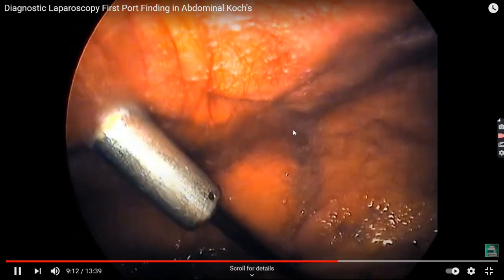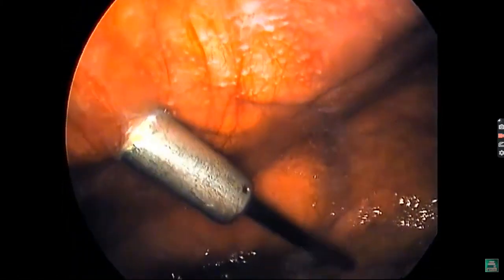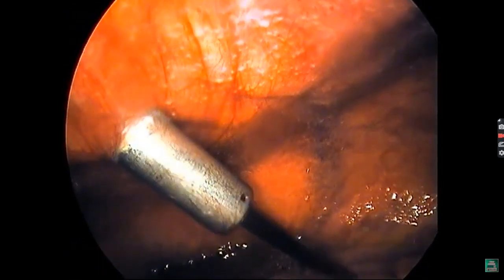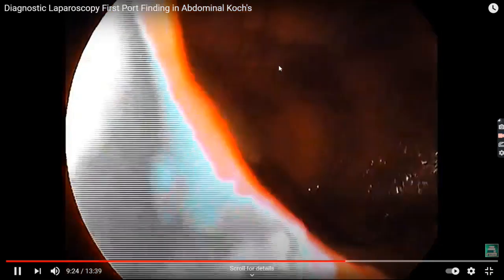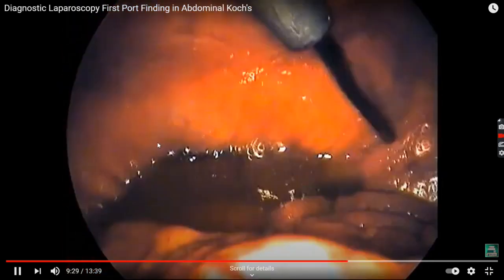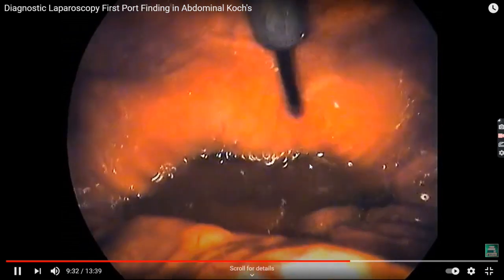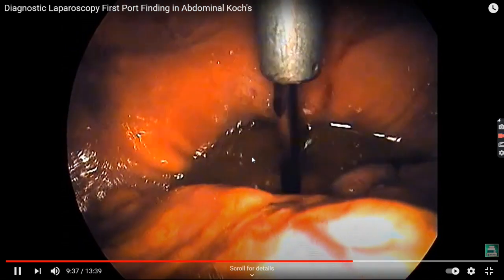And probably due to somewhat inadequate white balancing in this telescope at this time, you can see the color of the structures is not natural probably, as per my understanding.